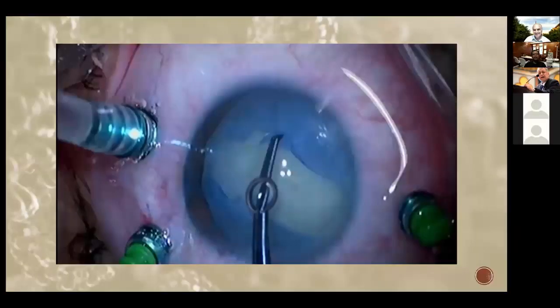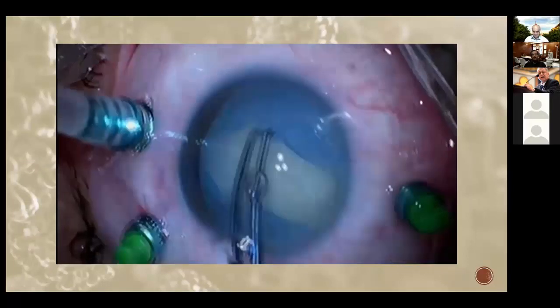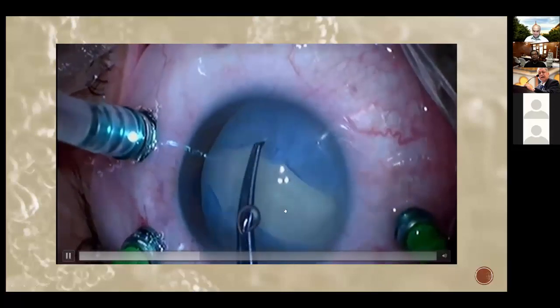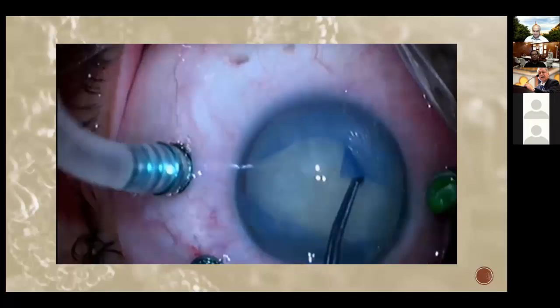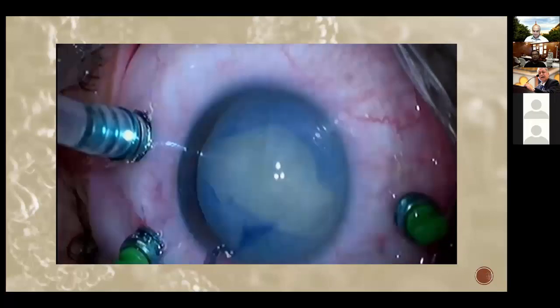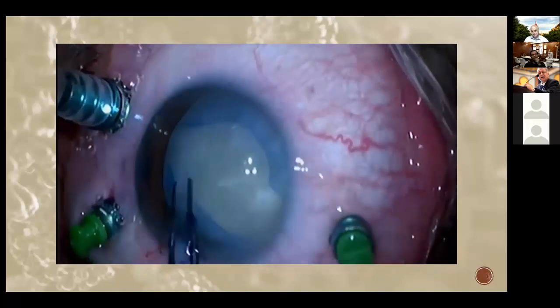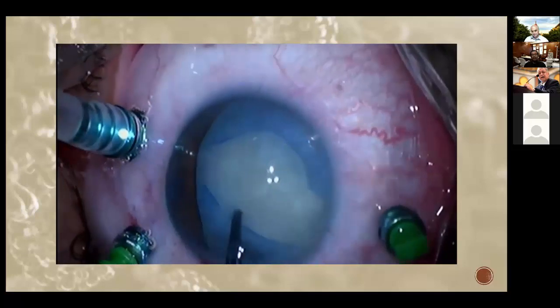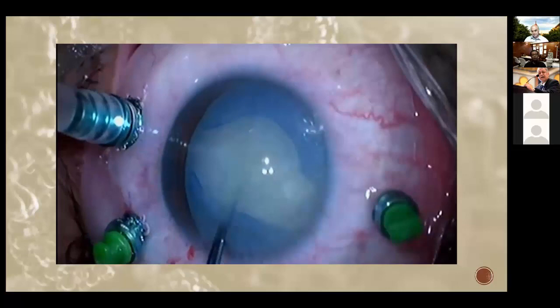But I want to show how to proceed in a case like this. I started making my edges rounded, making small tears in the capsule and taking rounded edges so I can have a space to go in with my phaco. I took in the first half and the second half, and now I can see this is a traumatic cataract in a young patient, in a young man.